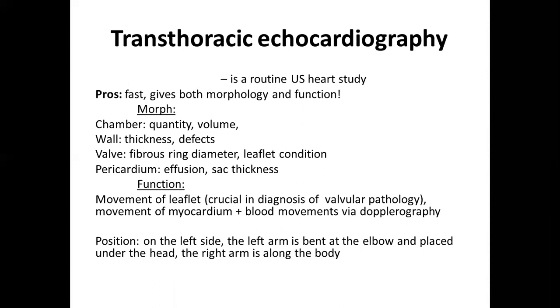We can assess the pericardium as well. We can see the effusions. We can see the thickness of the sac. So yeah, that was about the morphology. Maybe later on you can add something on the actual practice and discussion of the topic.